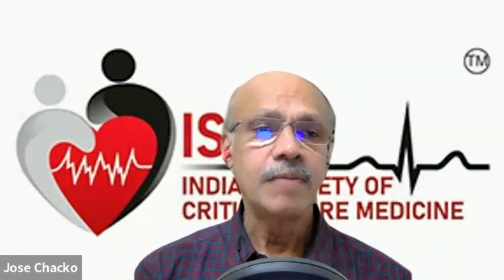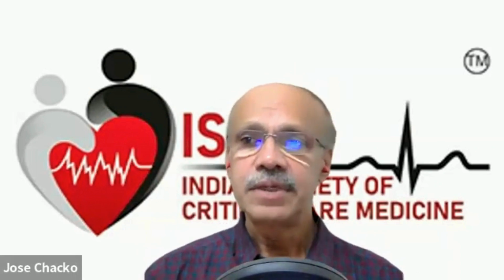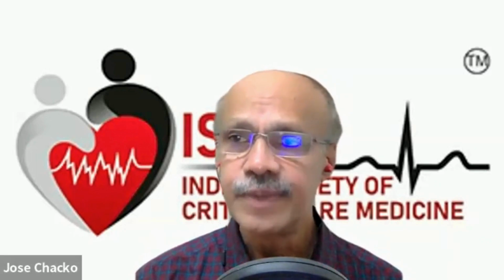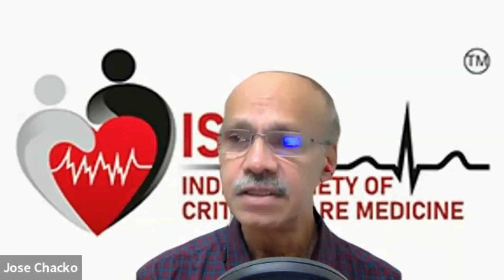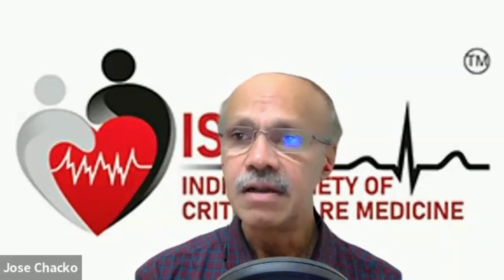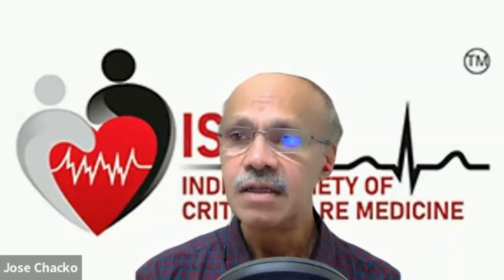Next, and most important, would be to look at the chambers, particularly the left ventricle. How is the left ventricular contractility? You don't need to have a precise measurement of the ejection fraction. You need not spend time to measure the left ventricular ejection fraction using the accurate methods that we know our echocardiographers do by the bedside.